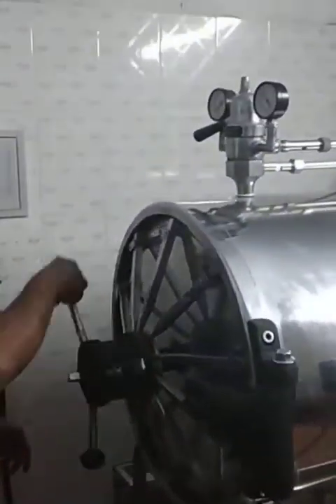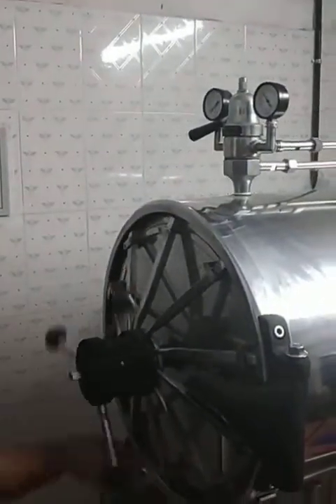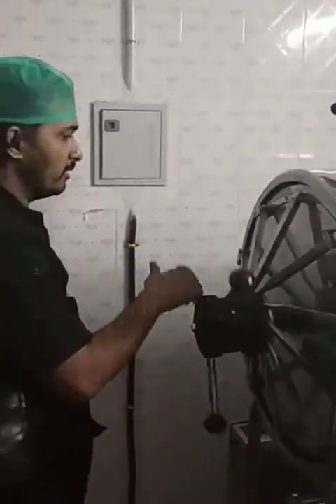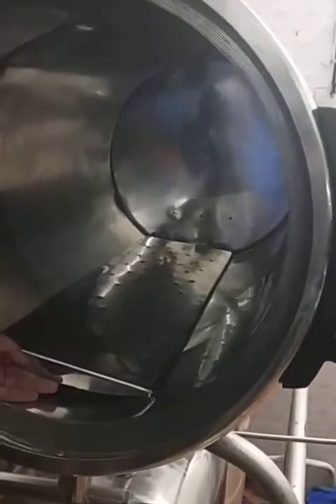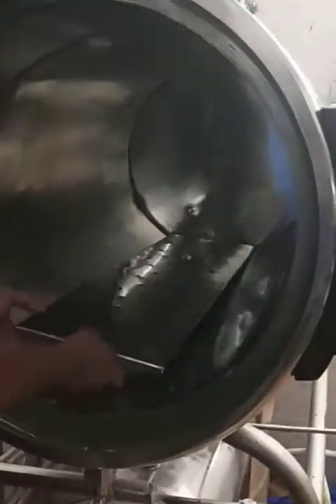This is the handle — anticlockwise is open. Now if you want to come inside and see: these provisions are for the steam over here. There are at least three different holes over there so that we have the facility to circulate the steam, with holes on the plate as well.